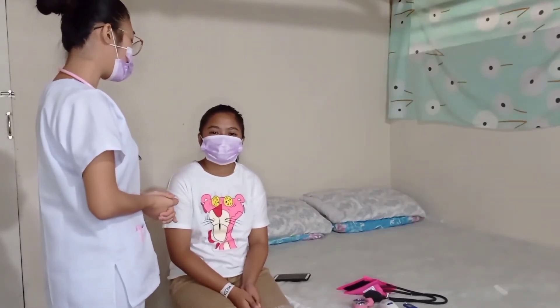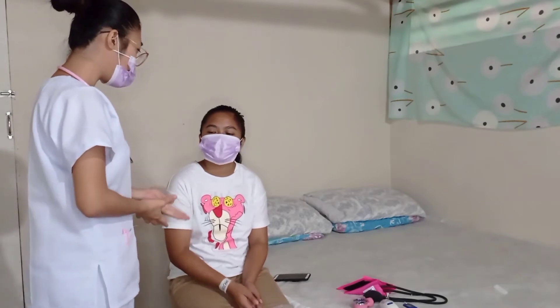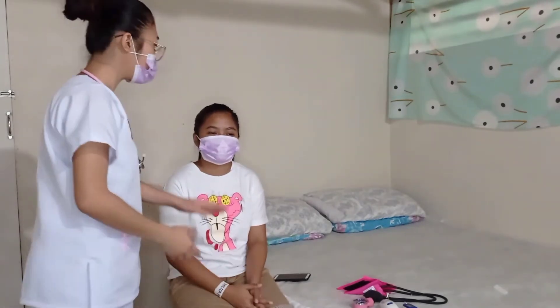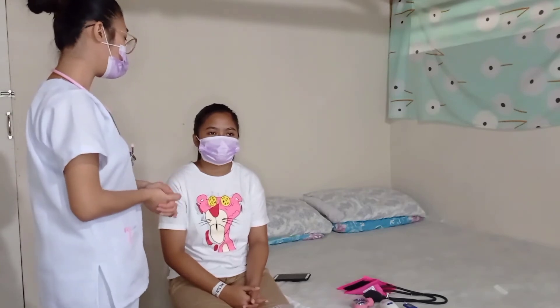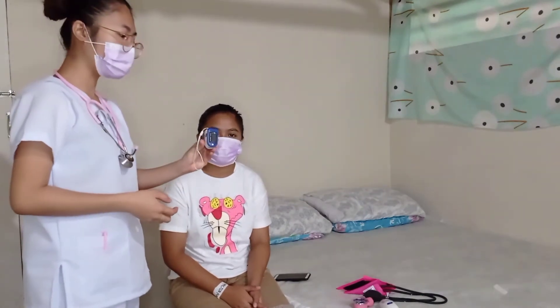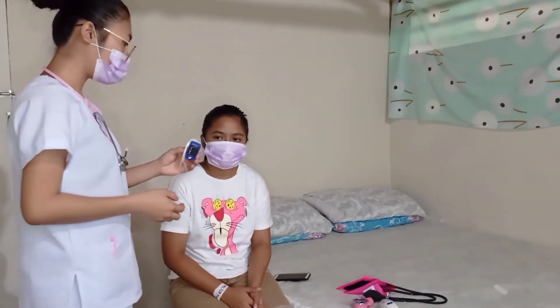Hi, I am Karla, your student nurse for today. I will be checking your vital signs. May I check your wrist? Okay, thank you. So now we are going to start with the oxygen saturation, using the pulse oximeter to detect her oxygen saturation.